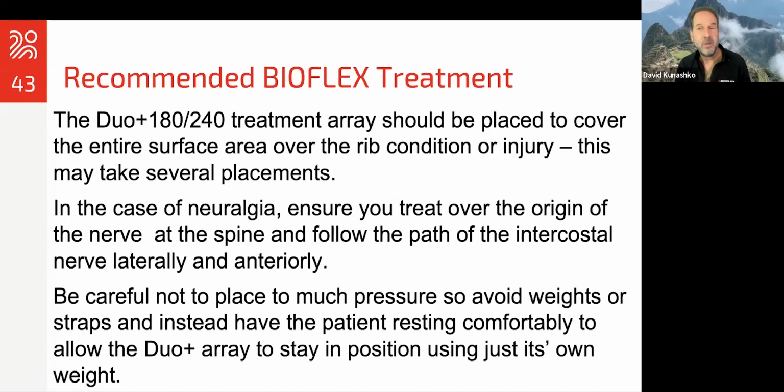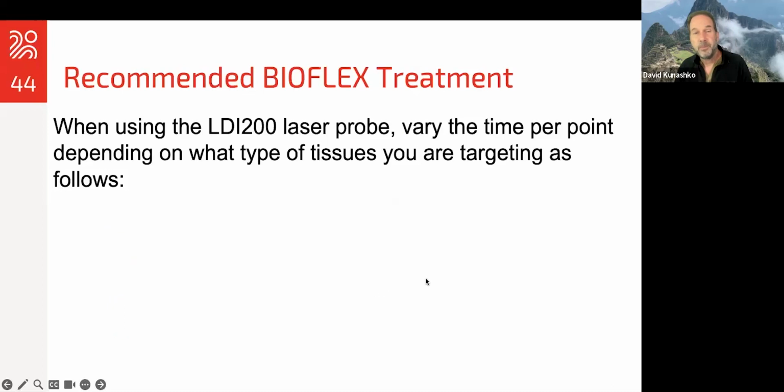If you do have our silicone ones, they're great for this application because they're much lighter. You can still use these, but you have to be very careful how you're placing them on the patient. Usually they can tolerate it. It's not that heavy, but don't compress it or push in like you would in other areas of the body, because obviously that's going to be painful.